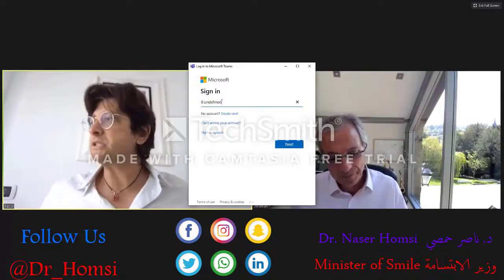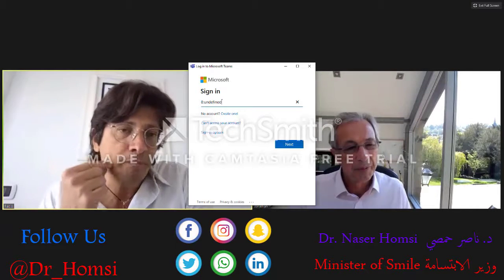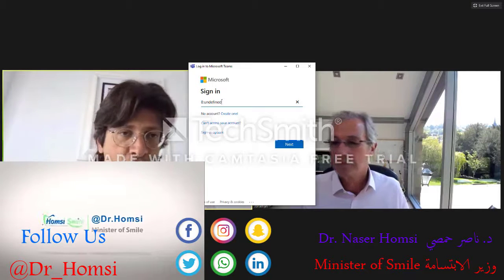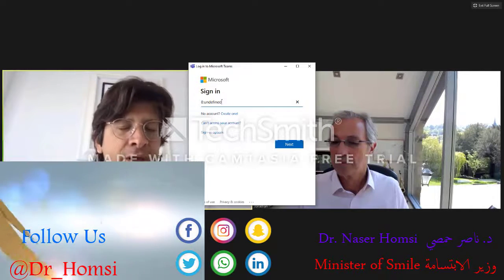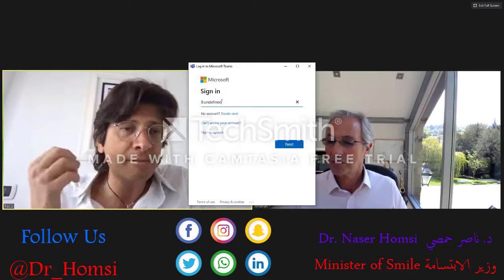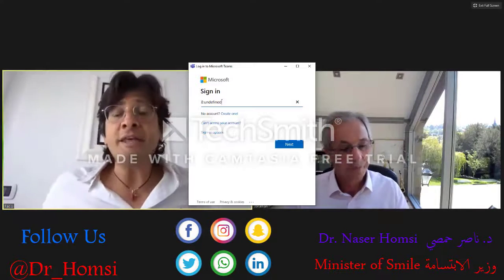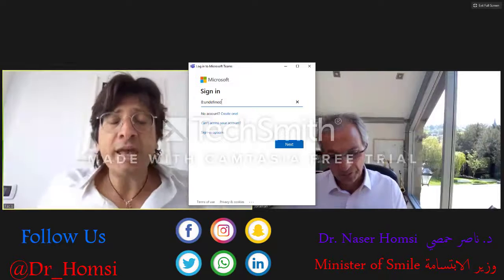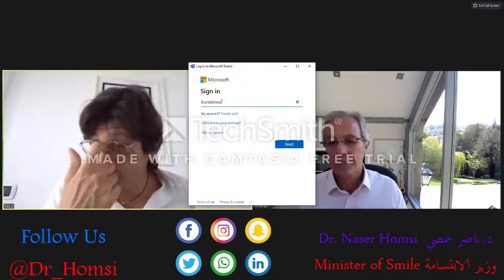Thank you, Jonathan, for this question. For class 2 elastics, if I have to apply them from the lower first molar to the canine, in a normodivergent or hypodivergent patient I try to use 4.5 ounces, 3/16. If I move from the second molar, I can use the same loading, but with 1/4, so a wider elastic. In this patient, the elastics were used for 5 months, on the right side full time, so day and night, on the left side only during the night.